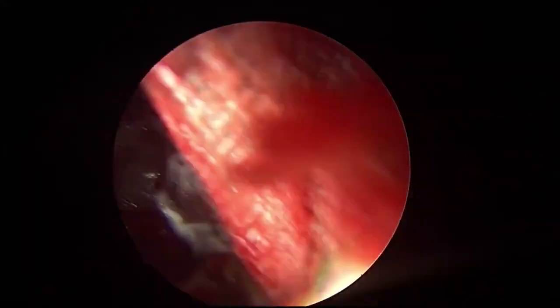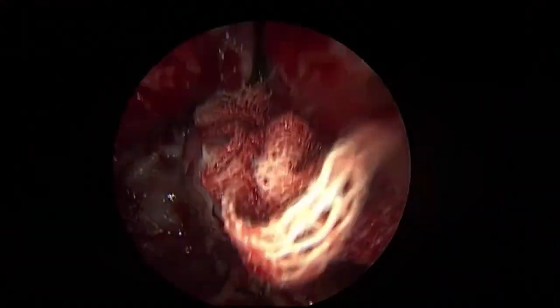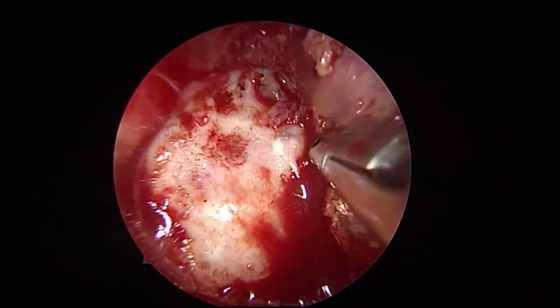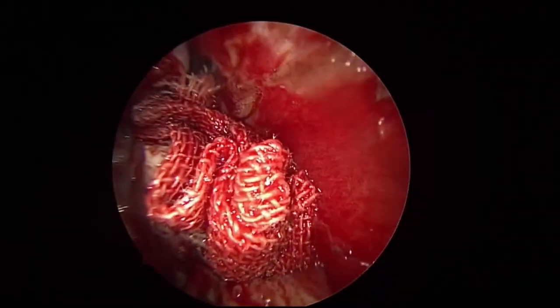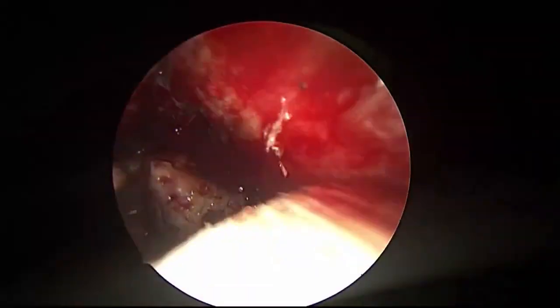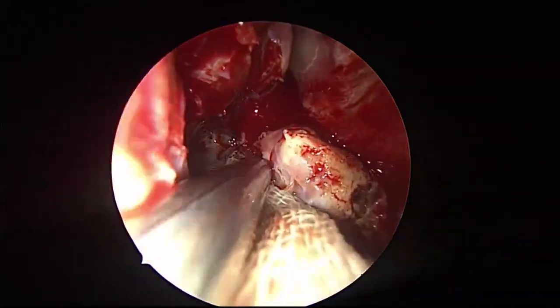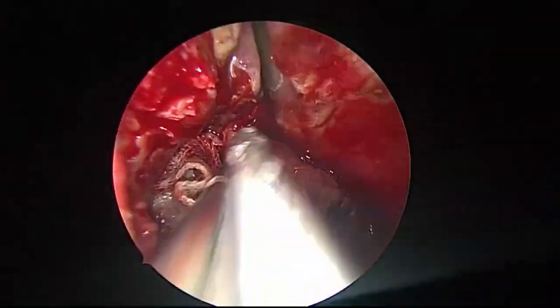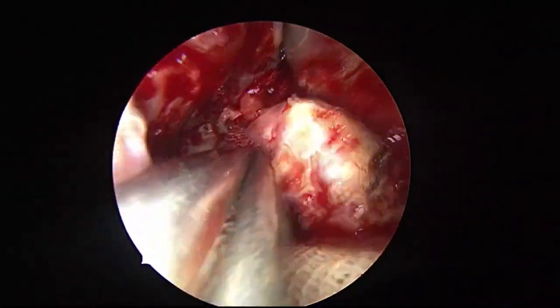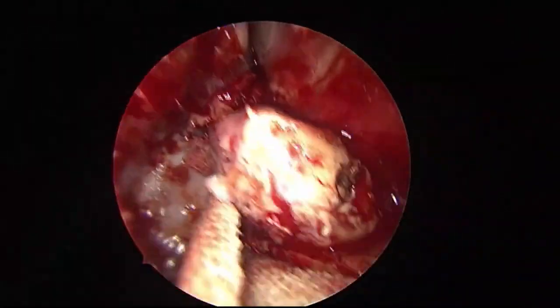Now is the time to go to the posterior wall. So that's the posterior wall behind. First, we are pushing this tumor medially.